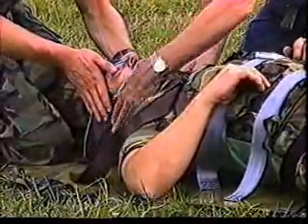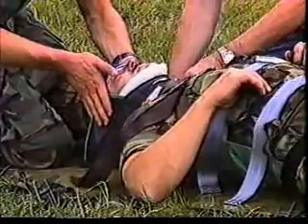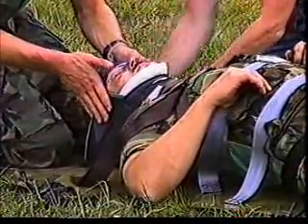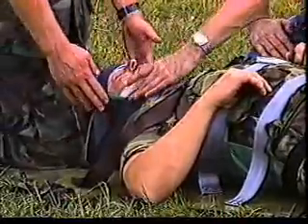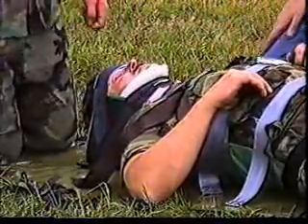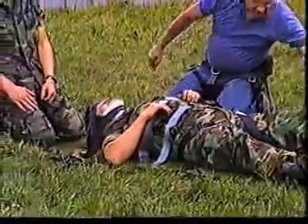This goes clear behind when we get the thing in a position where we can put enough tension on this collar strap that it secures, but not enough to distort the collar itself. And then you know you've got it tight enough and it's secure. But now, what if he has a clavicle fracture?